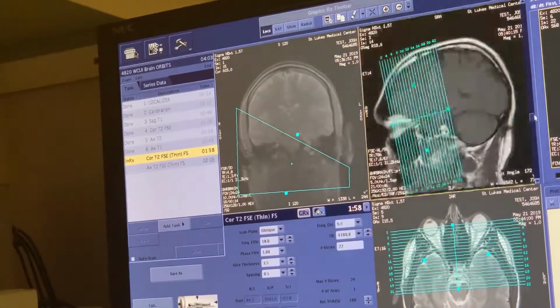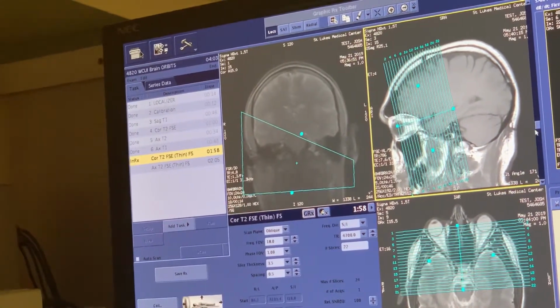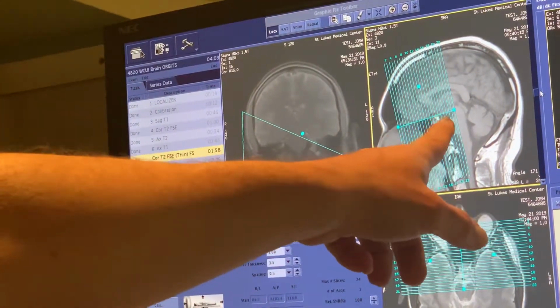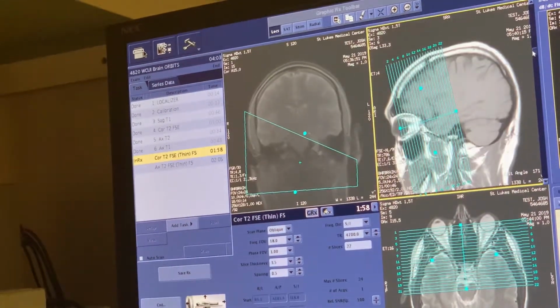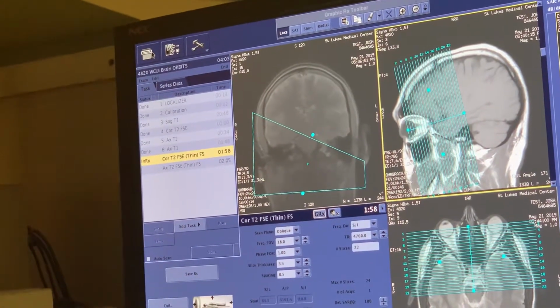And then you go back to the edge, the orbit. Make sure that you're, again, right in the middle of the optic nerve, like that. The chore is to go back from the mid-sagittal, looking for where the optic nerve enters the brain, to the orbit itself, to see where it originates in the eyeball, so that you have that exact angulation right there. So now I like this angulation.